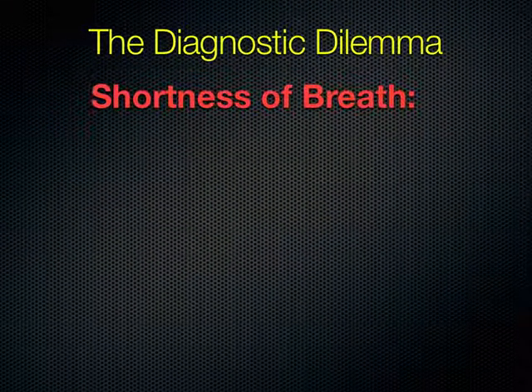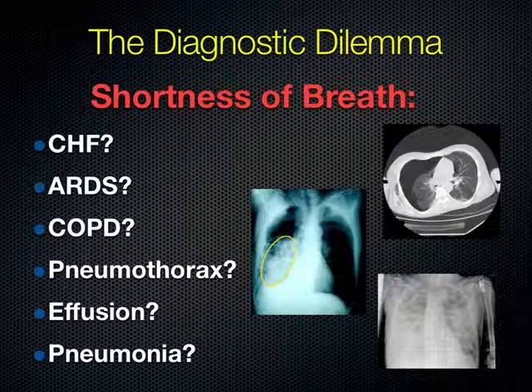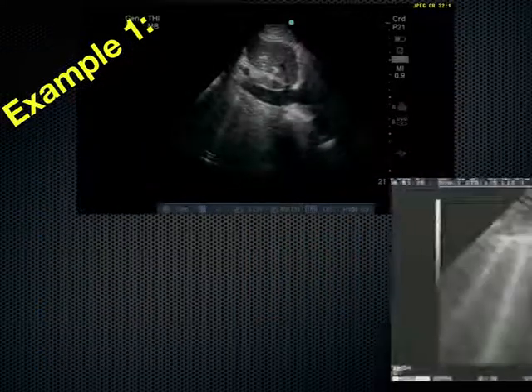So here we go with a diagnostic dilemma. Shortness of breath. Do we have CHF, ARDS, COPD, any number of things? What's going on with this patient? In order to get a jump start on the appropriate therapy, use your ultrasound.